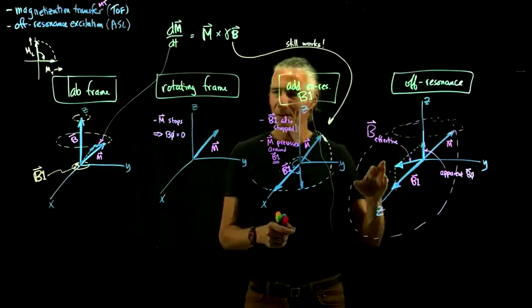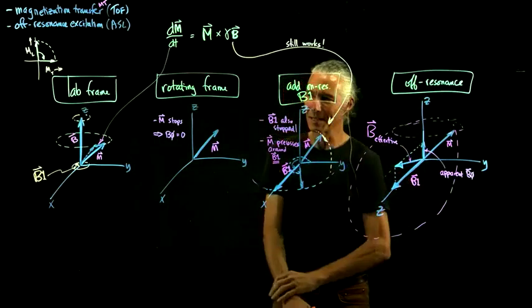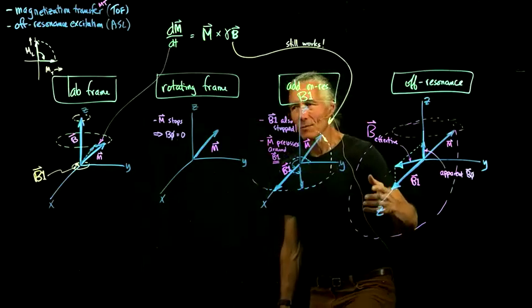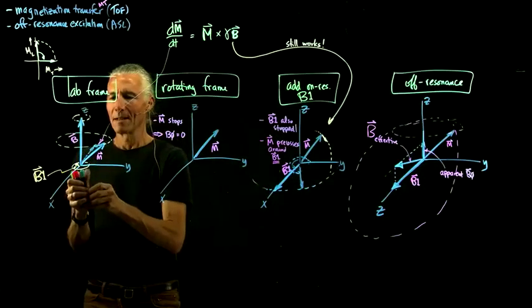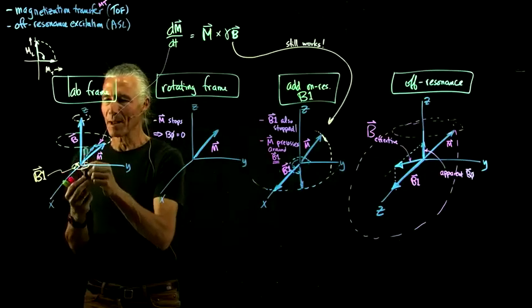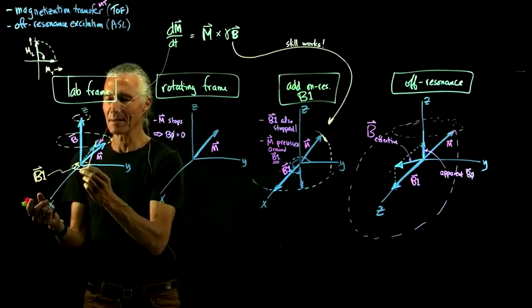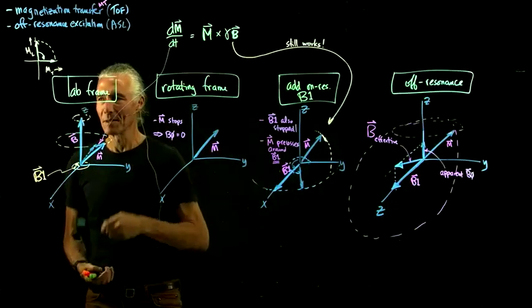And it took me a long time to figure out this picture. I saw it repeatedly, and the first time I just didn't process it. But I finally got it, going through it a couple of times. It's basically a way of visualizing what's going on that's easier to think about than the actual situation, which is precessing protons precessing very rapidly, and a B field with a B1 field added to it that's wiggling possibly at a different frequency, and what's the end result of applying this equation repeatedly.